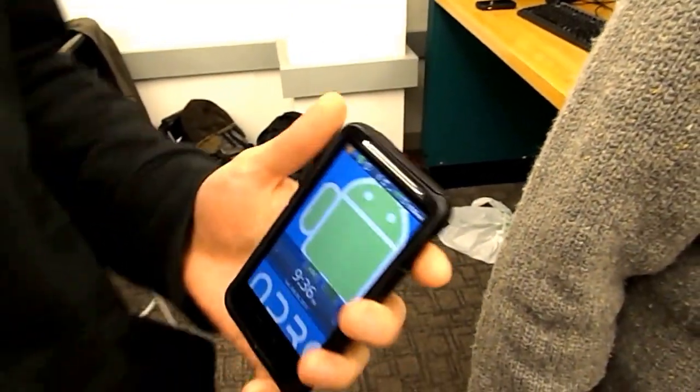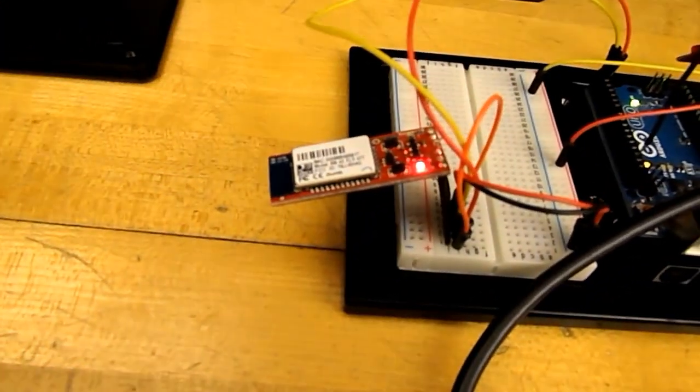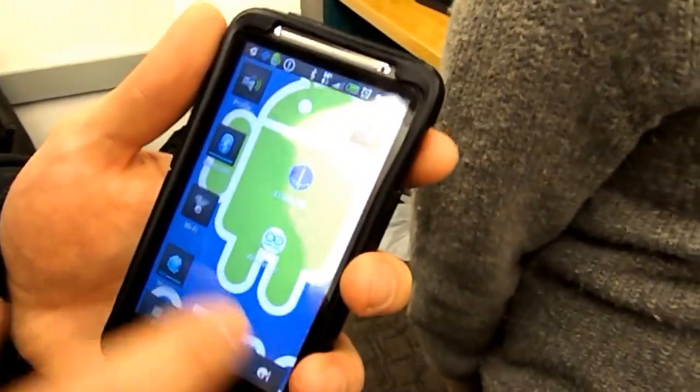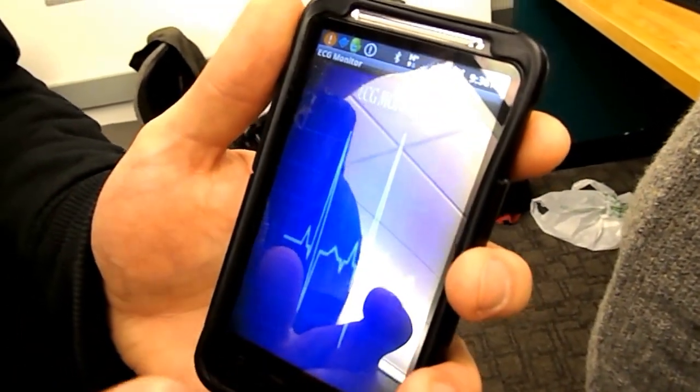Well as you can see the Bluetooth module is blinking red, and that means it's not yet connected. So in order to pair it we access the ECG monitor app that we've developed.